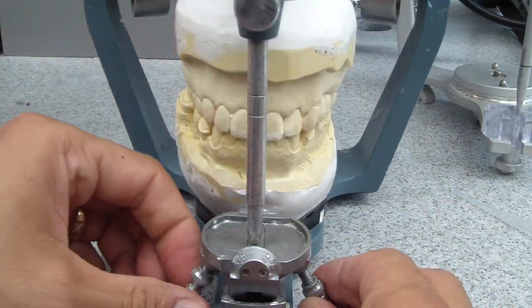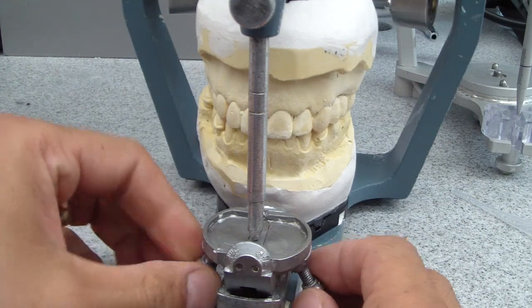If any angulation changes, we'll modify it. And lock these in.